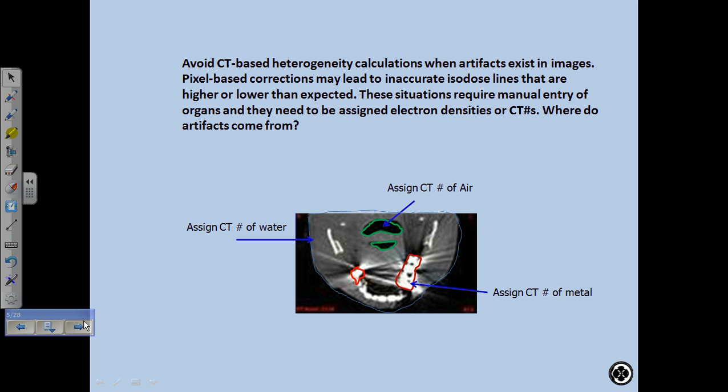Would the bowel CT number affect the target volumes? Okay, so when you're planning this, you're going to contour your bowel, all that white area, and assign it 1. Then your other structure is by default 1, isn't it? Well, you have your tumor volume and your PTV, and your PTV extends into the small bowel. Will it read that area as 1, or do you have to manually contour that bit?